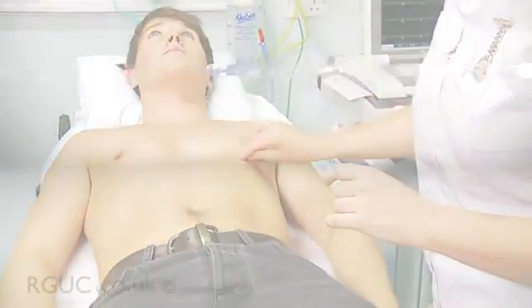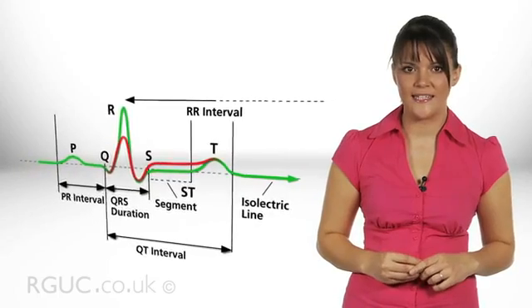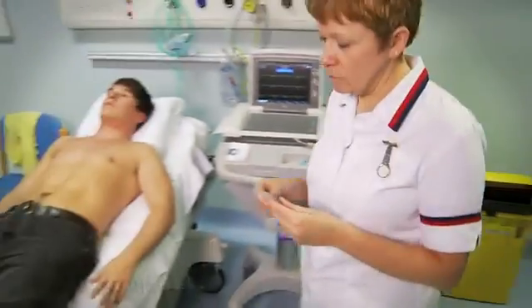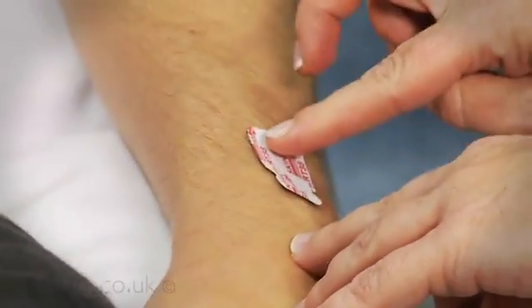Once the skin has been prepared, attach the electrodes and leads. Incorrect placement of the electrodes produces diagnostically significant differences on the ECG and as a result patients can be treated incorrectly. Ensure the centre of the electrode is located in the appropriate position. First, attach the electrodes for the limb leads. There are four limb leads. On the lower limbs, attach an electrode proximal to each ankle, and on the upper limbs, attach an electrode proximal to each wrist.